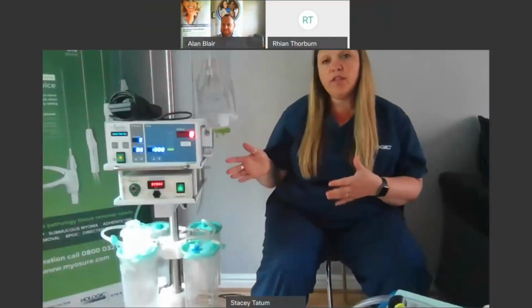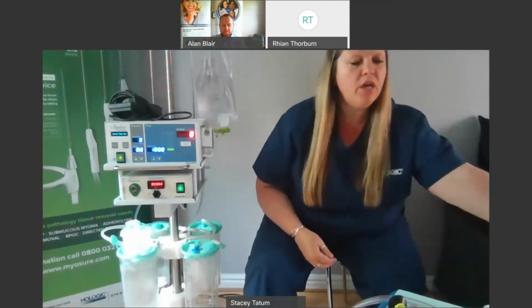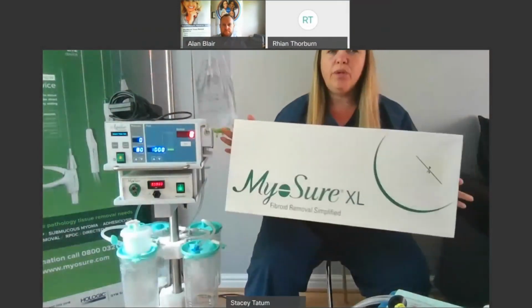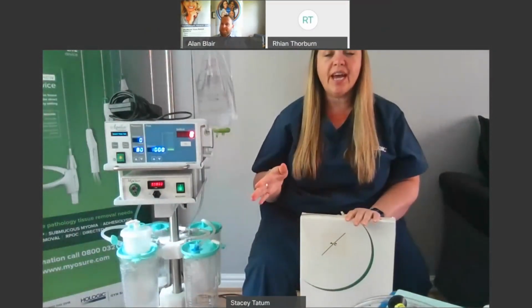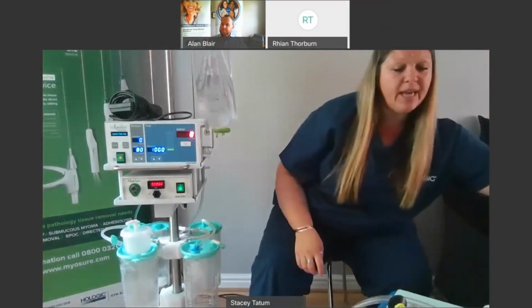Thanks, Alan. So we've got the system set up and ready to go. Now we just need to check that our consumables. So what you'll need for your MyoSure procedure is your normal hysteroscopy set. You'll need a cutting device, a MyoSure cutting device. You won't know which size you'll need until the surgeon's gone in and had a look. So it might be worthwhile having one of each on standby.